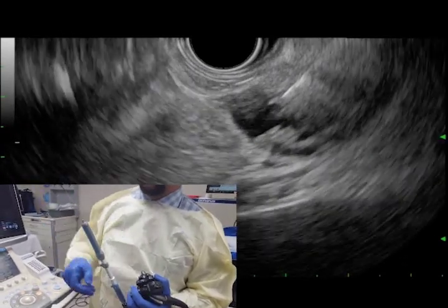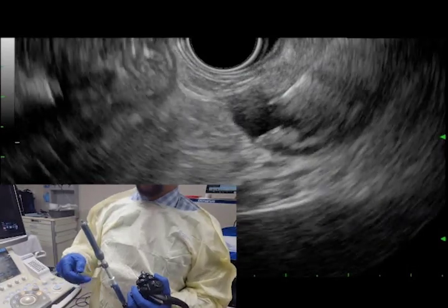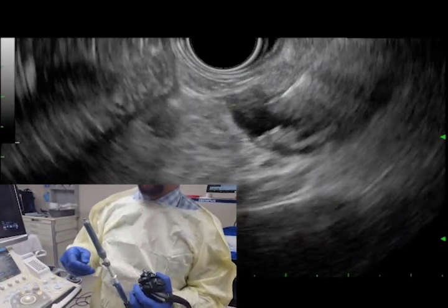Tenting should be observed and a tactile bite should be appreciated. Case 2: cyst septum biopsy.